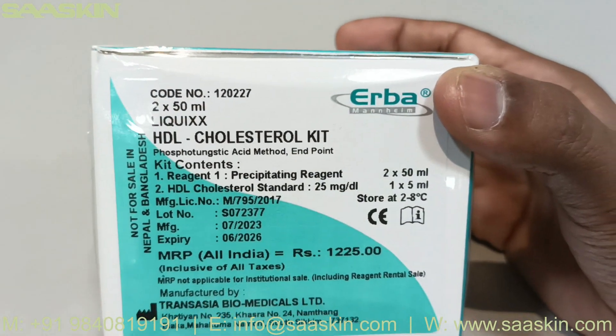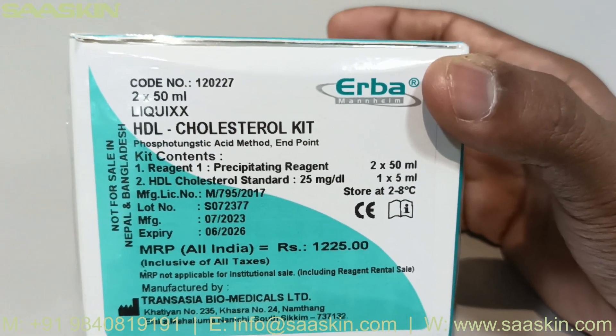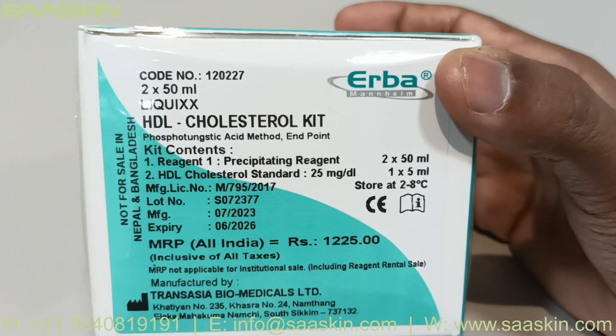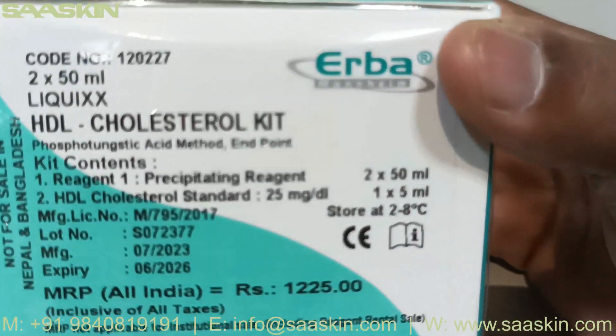This kit contains a precipitating reagent of 2x50ml volume and an HDL standard of 1x5ml volume. The concentration of the HDL cholesterol standard is 25 mg per dL.